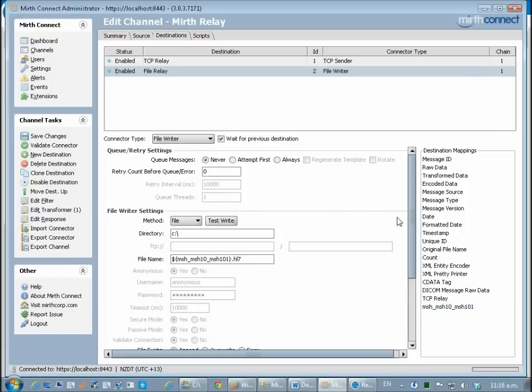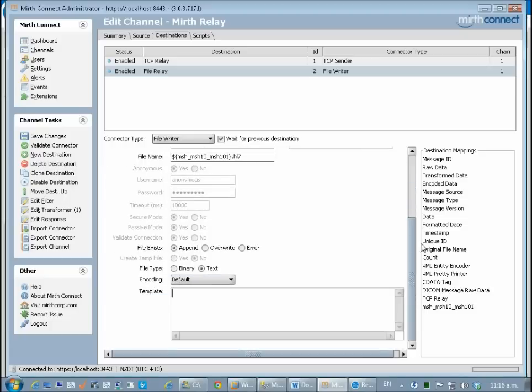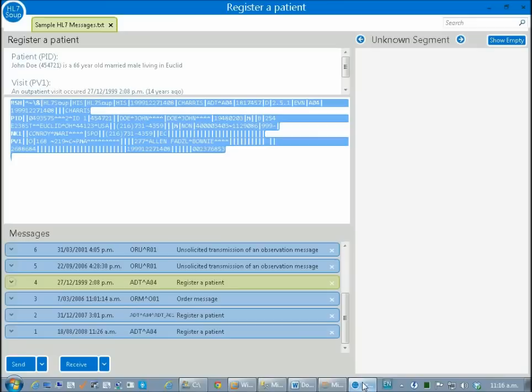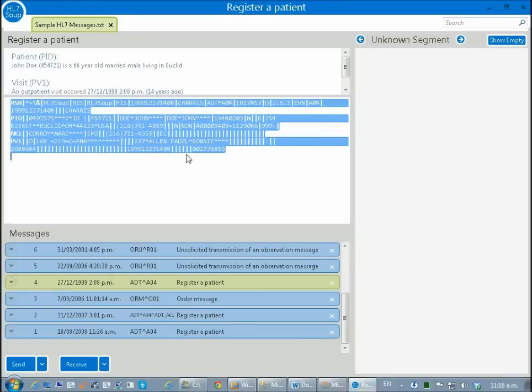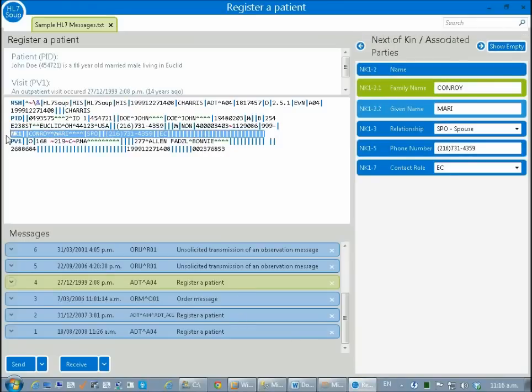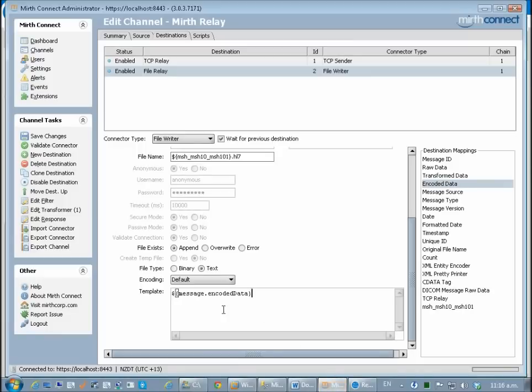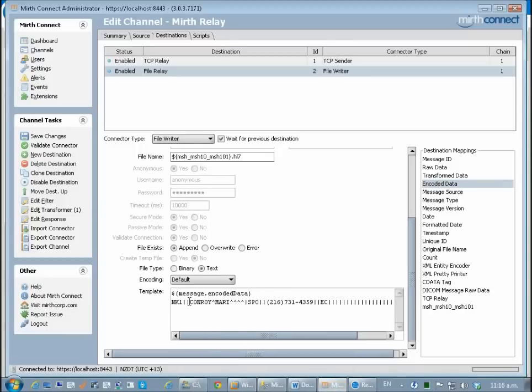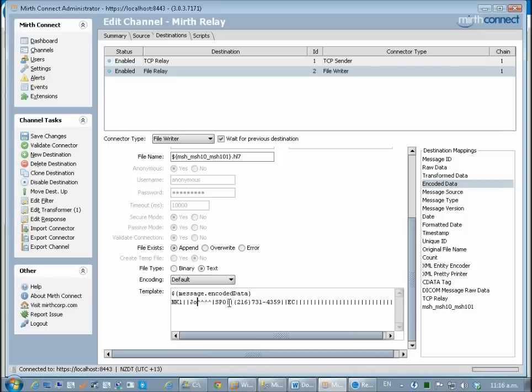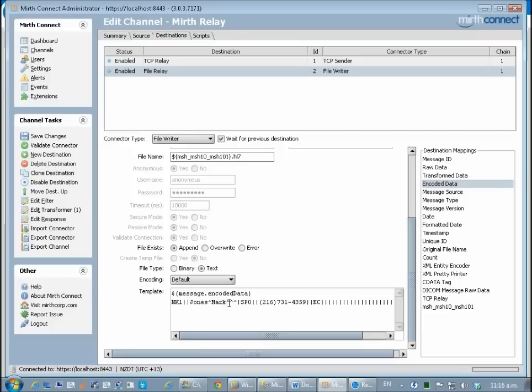Into this message I'm just going to put the encoded data which is the message that came in. I can just drag that down and paste that in there. I will also put in this next of kin information. For this particular one I'm going to change the name to Jones. Now we've completed our relay.